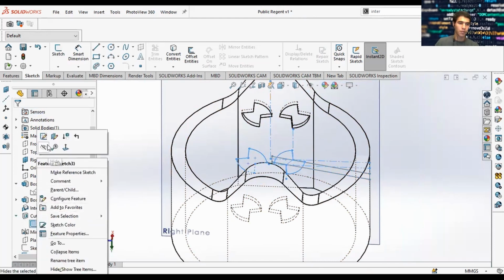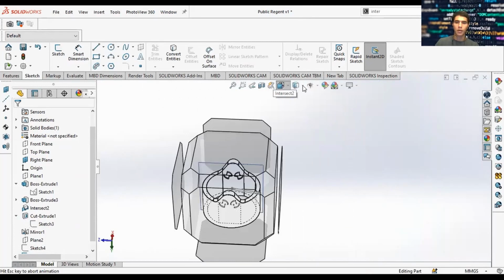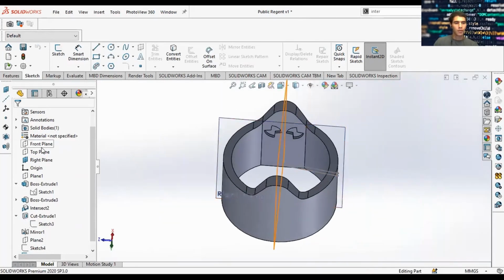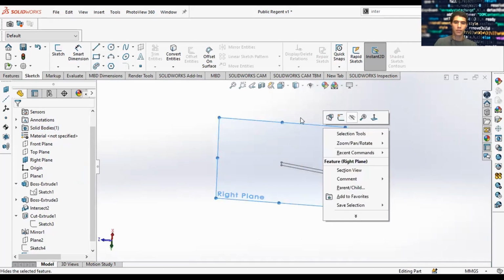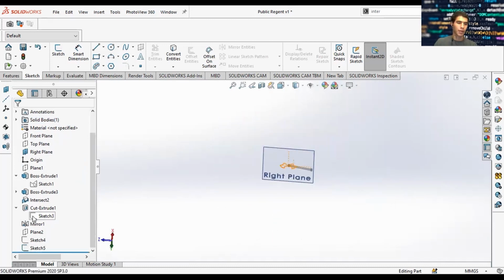Let's hide sketch number 3. Bring this back as a solid body. We'll bring our solid back like this, and we'll hide it. So now we're hiding our solid body. It's gone. And let's keep that there. And we'll bring back our sketch number 4 to show it.